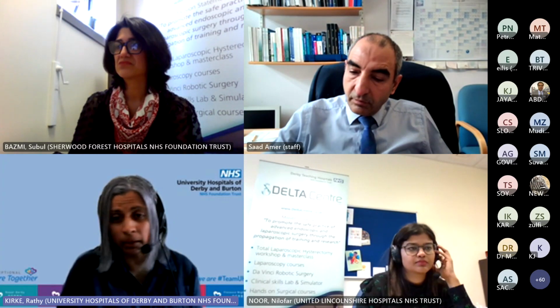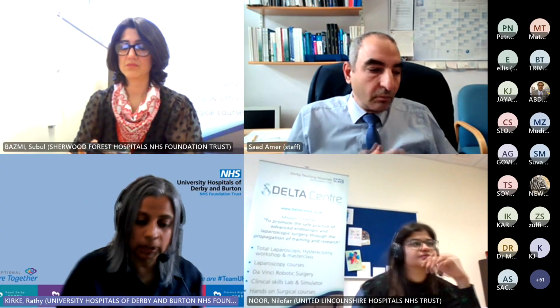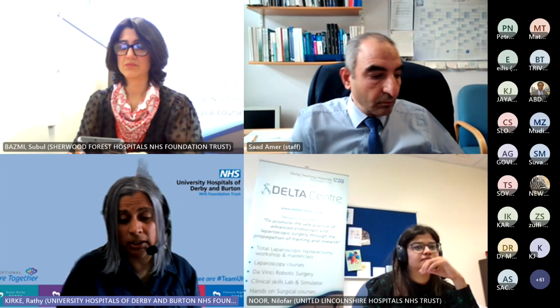I'll be honest with you, we don't always pick it up, because some small plaques you wouldn't see on MRI, you'd see them on laparoscopy. But as I showed you with the cecal plaque, we are looking for it. We're not just looking for pouch of Douglas disease and chocolate cysts on ovaries. We're actually looking through the serosa of the small bowel and the pelvis. We're looking at all the large bowel image quite closely, and we try and do our best, I guess.